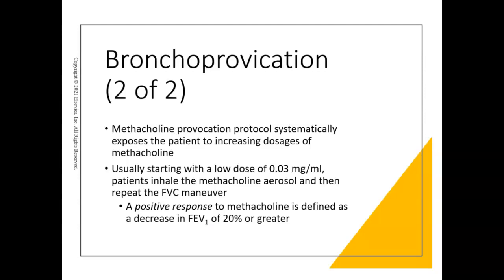Okay, so let's say I start off my procedure. Again, I start with a baseline FVC. So usually you do at least 3 maneuvers, right? Because we always have to have them repeatable and reproducible. So we usually get 3 for your baseline. Then I'm going to do the diluent one, and I'm going to do an FVC, and I'm usually going to repeat that at least 2, depending on your PFT lab. Every PFT lab I've ever worked in just makes you do 2. So now we're up to 5 FVC maneuvers.